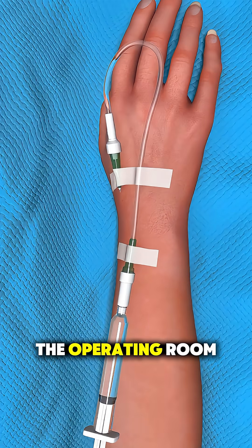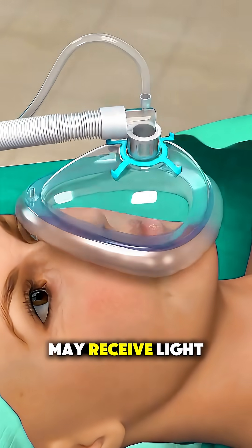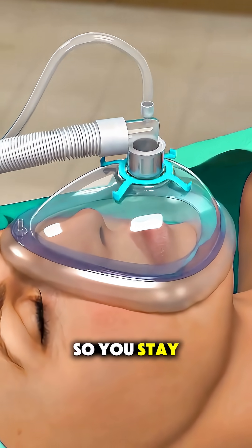Once you're in the operating room, the hand is numbed, or you may receive light anesthesia so you stay comfortable.